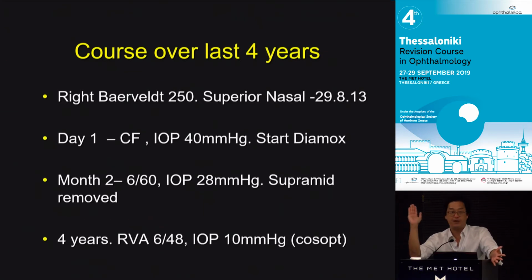It may be fine because by then the inflammation is gone, they're not on steroid, and it doesn't matter what you put in at the beginning, right? So it is important to think about why Xen may work in this case. I think some people have good results, and that is because of the temporary nature of the uveitic glaucoma, rather than the Xen itself being successful long-term in terms of draining. That's my experience. Okay, thank you.